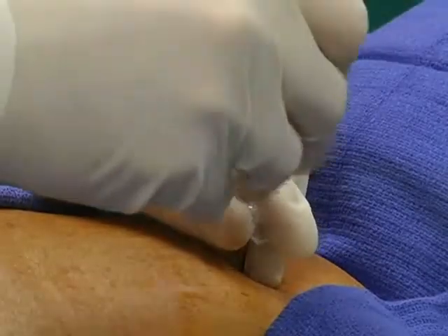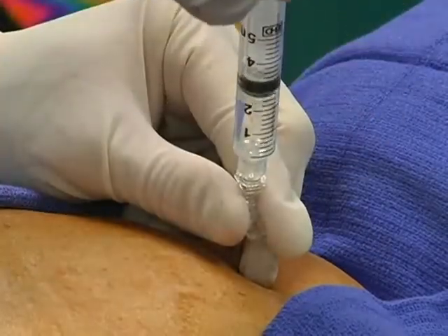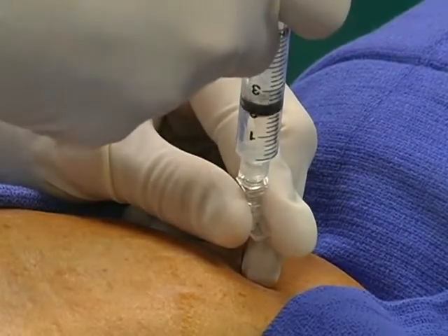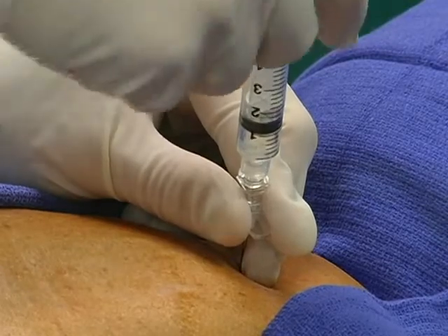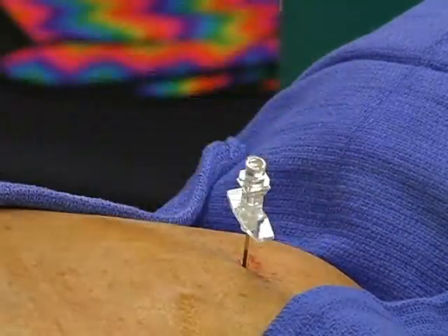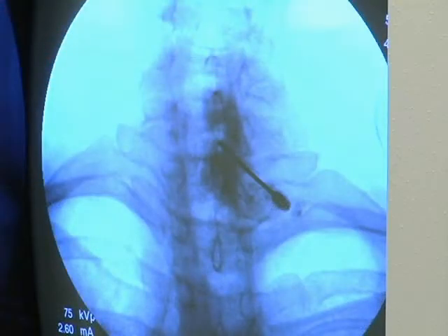When loss of resistance has been achieved, aspirate to check for blood or spinal fluid. If neither blood nor spinal fluid is evident, inject 1.5 milliliters of non-ionic contrast dye. Confirm epidural placement by producing an epidurogram with the non-ionic contrast agent.